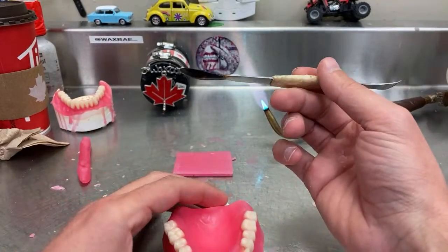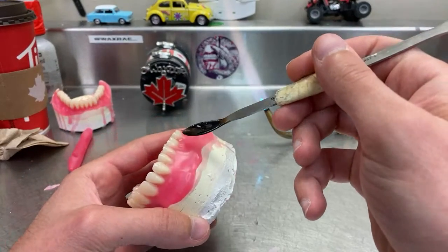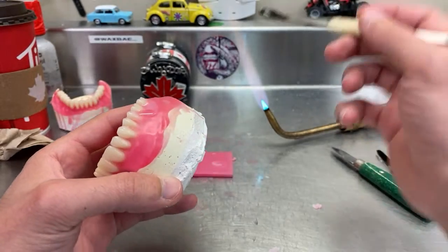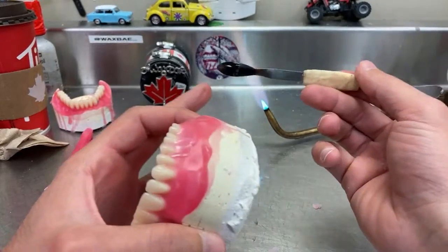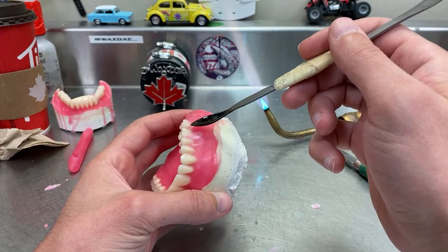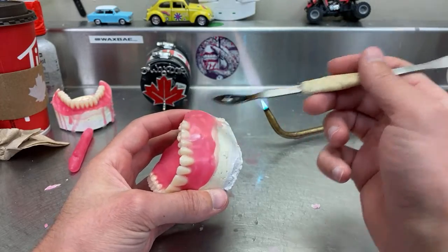Okay, so I'm gonna show you how this is done here. You heat it up and you just scoop wax, and I used to go like this and add wax. Nice, but I don't like it for one reason, and that reason is when you heat up this and you're taking wax, when you touch the wax, you're actually digging the old wax and adding a new one. So it will take a couple of attempts in order to fill it to how you want.